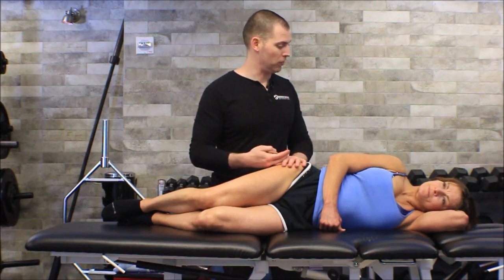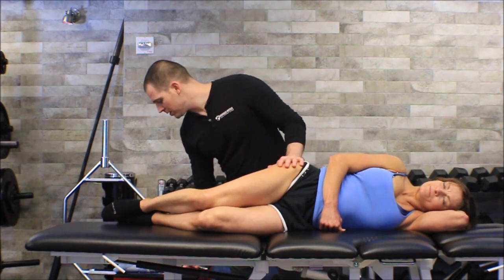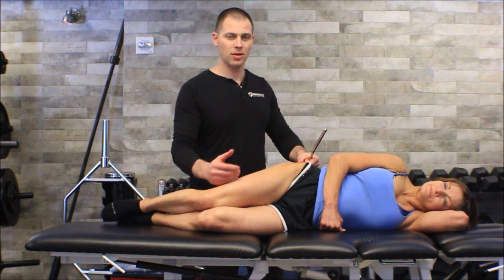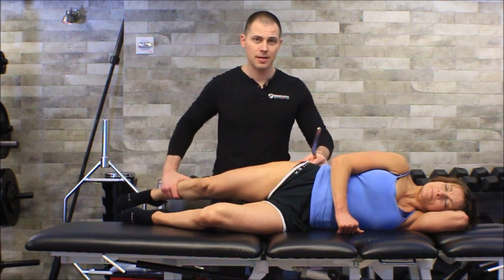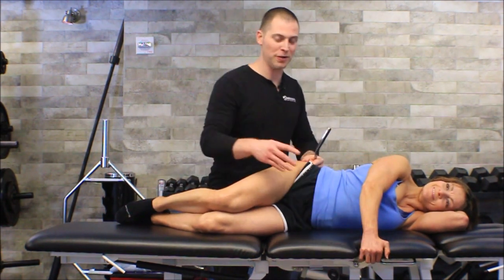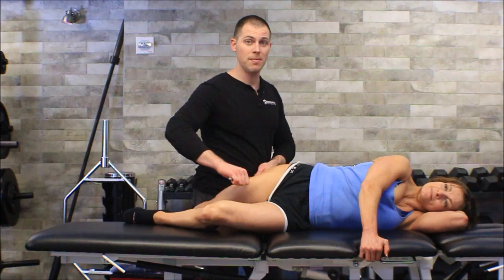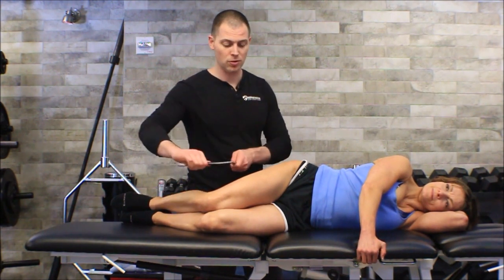The last step is to go dynamic with this. This is a tender area so we need to be careful. I'm going to use the larger tool. The trick is that the tissue is going to get tensed — we're going to lengthen this tissue if she goes back into extension and lets her foot fall off the table, going into extension then adduction. It's helpful for the patient to hold on to the end of the table so they don't feel like they're going to fall off. You're going to hook some tissue in, and right over those same areas of dysfunction, just do a few strokes — three to five strokes is more than enough.